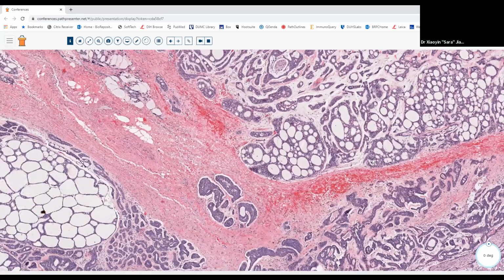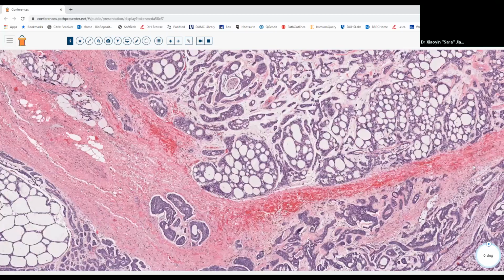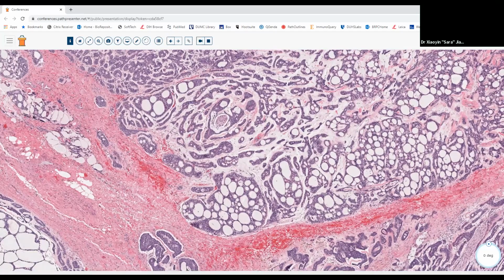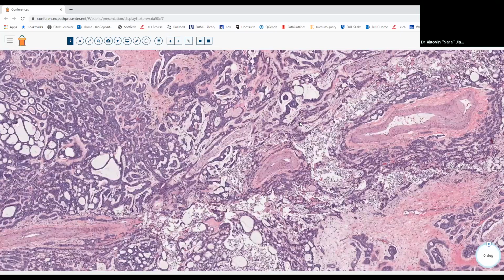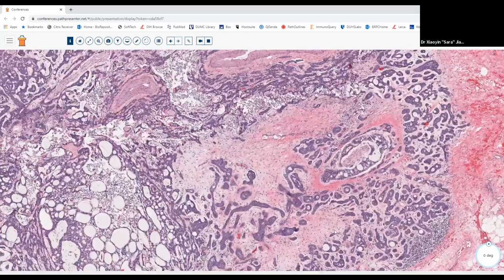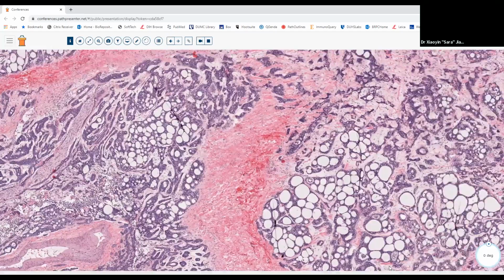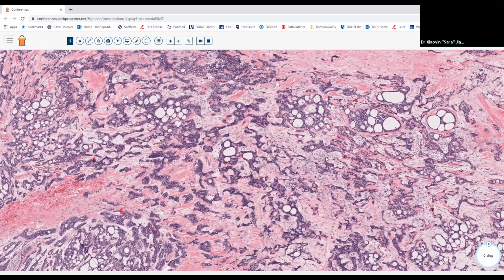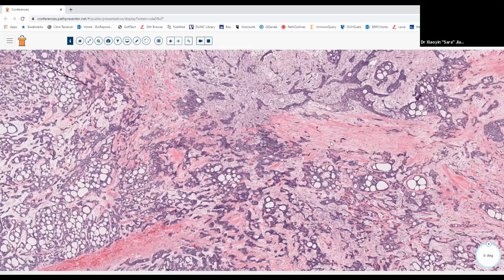The other thing that I want to highlight here is you can get multiple different histologic patterns. So you can get tubular. So this one, we have a lot of cribriform patterns. The tubular areas are not super well developed in this one, but let's see. This area is a little bit more tubular, and you can get solid areas, which are said to be more aggressive, as well as being more of a diagnostic challenge, right? So sampling, again, very, very important, because there can be lots of variability within these tumors.